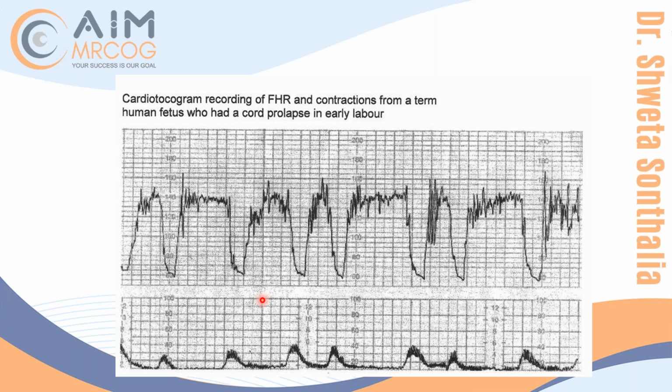First of all, you told me early, right? Yes, ma'am. We always get confused because we get biased by seeing the synchrony with contraction and we don't note the finer detail. If you see the drop exactly is falling after the contraction, or if you see the peak and the nadir, it's not corresponding exactly. It's not like an image of a contraction. It's not a V-shaped thing, gradual fall, gradual rise. And early will not go so deep, believe my friend. Early will not go to 60 for sure.